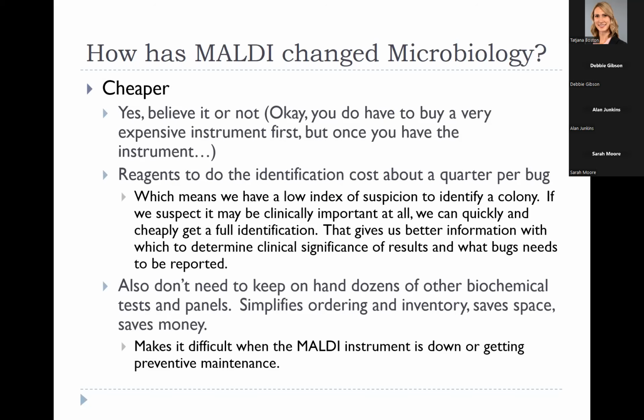So how much does all this contribute to saving patient lives, better outcomes? You want to include that as well. So is it worth getting? Those of you who don't have MALDI yet, is it worth getting? No question. Absolutely, it is worth it. Moderate to large laboratories, this is the standard now. If you're not using MALDI, you are behind the times, and you need to get it now. Small laboratories, it's going to be a little bit harder. The return on investment is going to take a bit longer to get back.